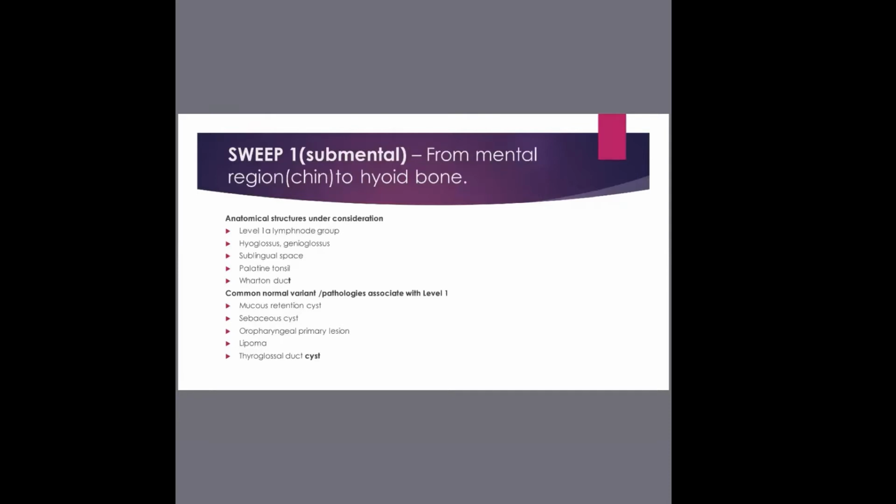But you have to bear in mind, they are always subcutaneous. And if you're using a good resolution machine, you always see a punctum. If you see a punctum, it tells you that this is a classical sebaceous cyst. The other name for sebaceous cyst is, what's it again? Epidermoid cyst. Epidermoid. So it's classical. You just see it.